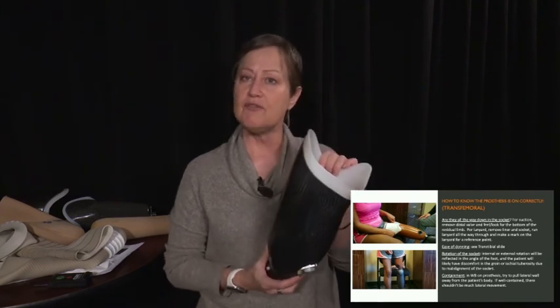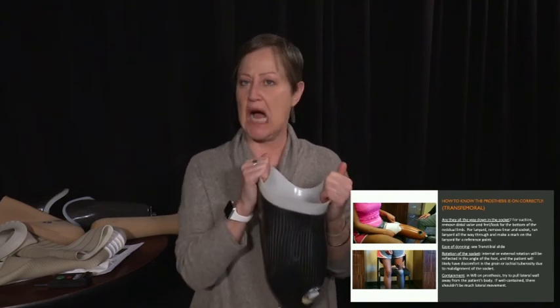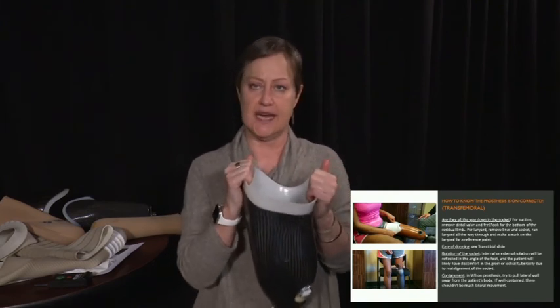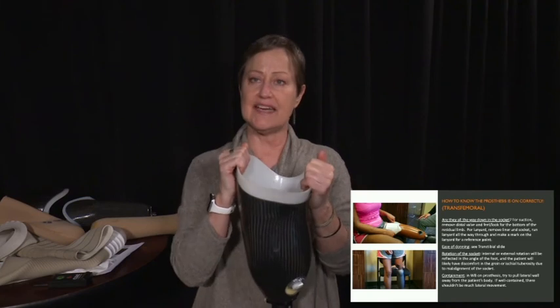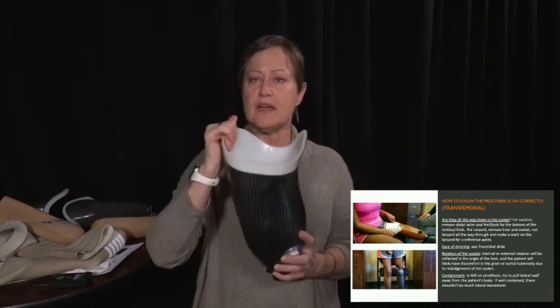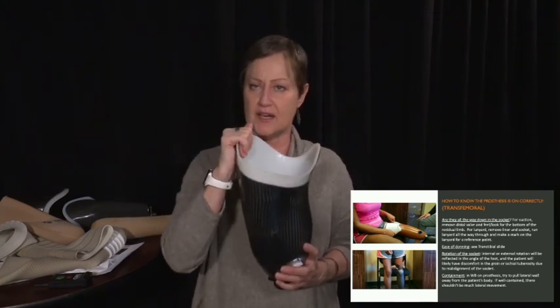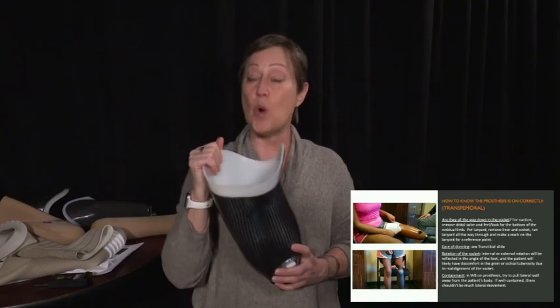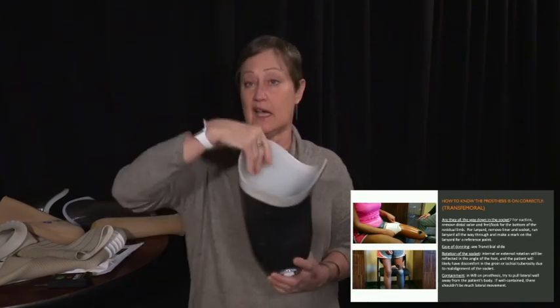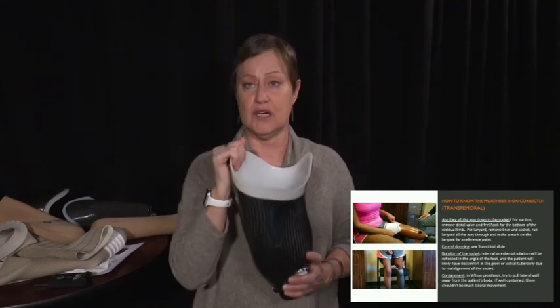The other thing for a traditional ischial containment socket is if they do not have good ischial containment. You're going to be able to tell that in standing if there's a really big gap, or if you pull on the lateral aspect of their socket in standing and it comes away from their leg, and again, you've got a whole bunch of room in there, then they probably are too small.